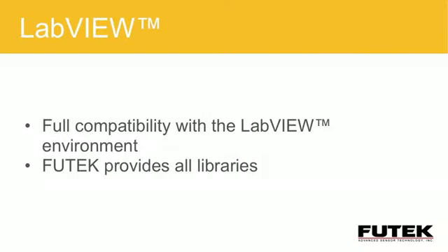The last option that we're going to cover today is LabVIEW. FUTEK's USB DLL is compatible with LabVIEW. LabVIEW gives you the ability to use .NET assemblies through several .NET nodes. You can instantiate a .NET object, you can call a method on a .NET class or object, and you can access a property on a .NET class or object. LabVIEW provides all of these features through the functions palette using the connectivity and the .NET extensions.